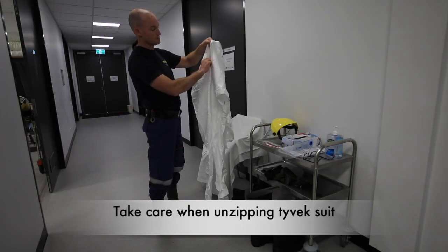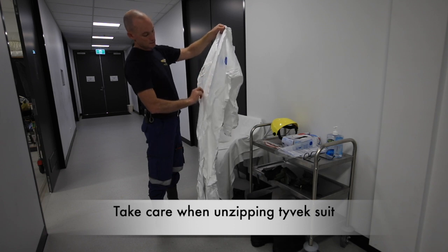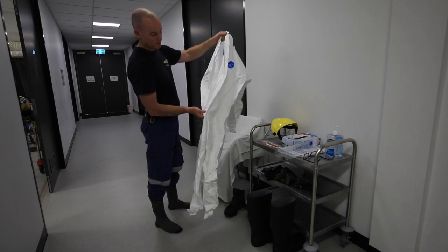Opening up the zipper on the Tyvek suit — just take care, it gets going fast and can catch on the garment at the zipper.